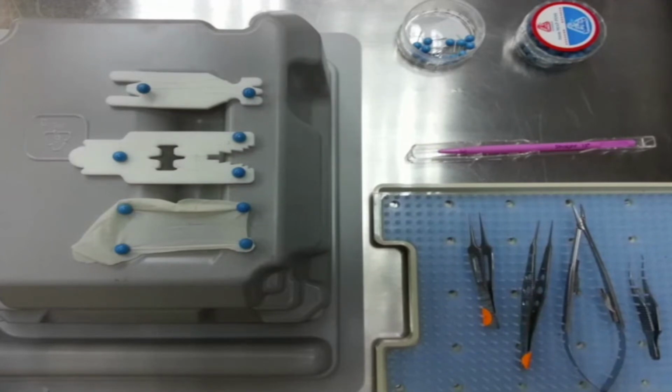The most important thing here is from the beginning, you need to familiarize yourself with the microscope. How to coordinate your eye and also your hand and also leg at the same time to adjust the microscope.